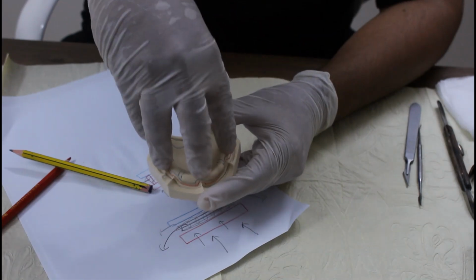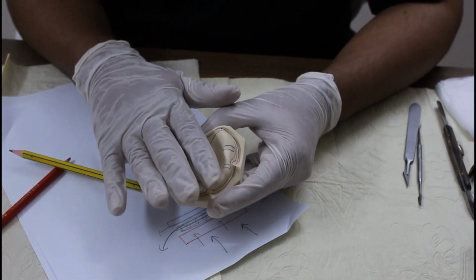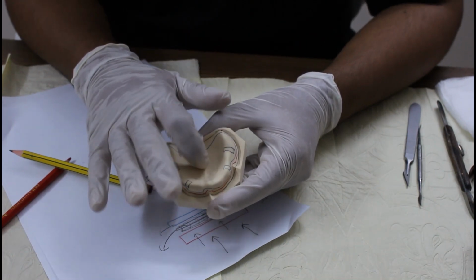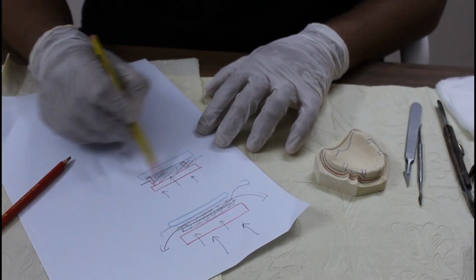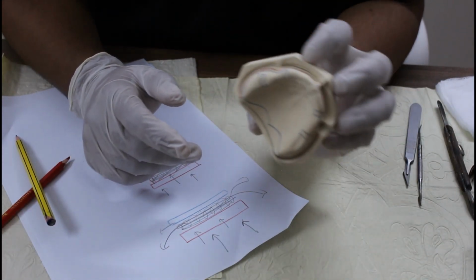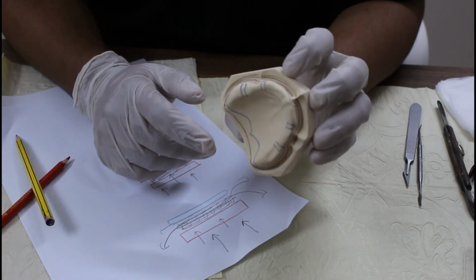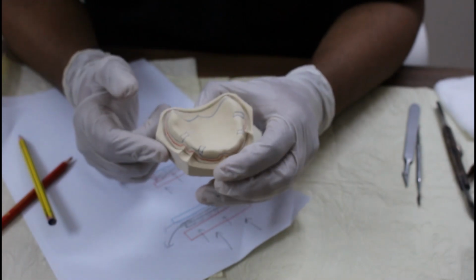So it will be like a stop. When we apply pressure, it will stop the tray from going towards the tissues. And what is the function? To maintain the space for impression material. It will keep this space so that impression material stays here. Okay. So once you draw this much, you have to show this cast to your supervisor first. Once they approve, then only you will go to the next step.